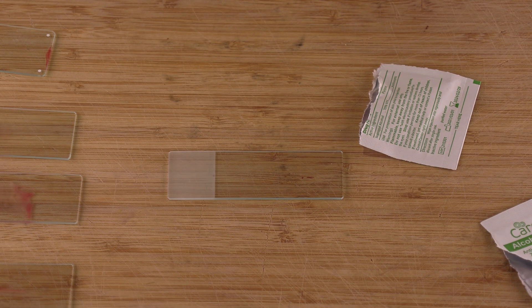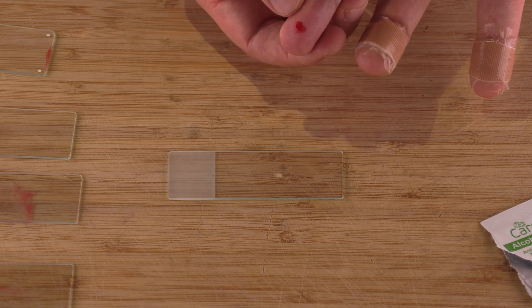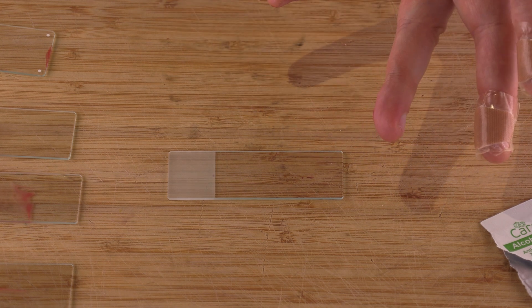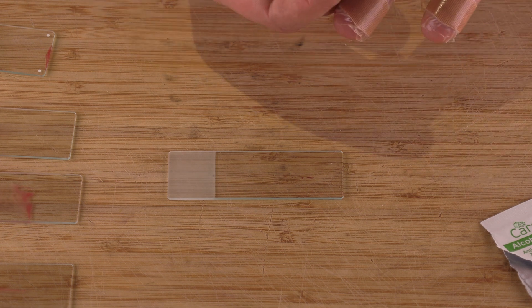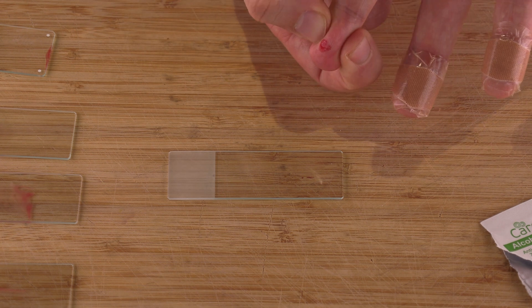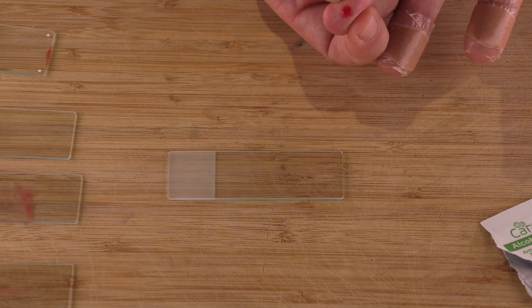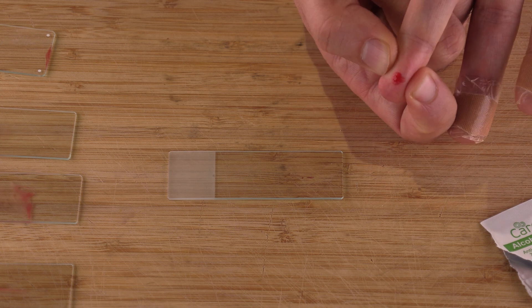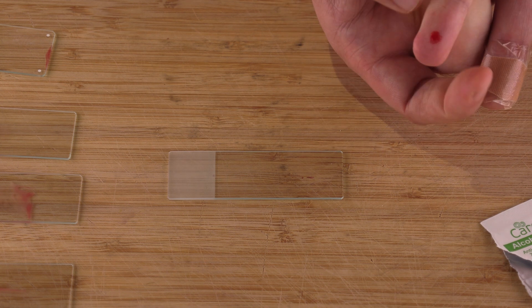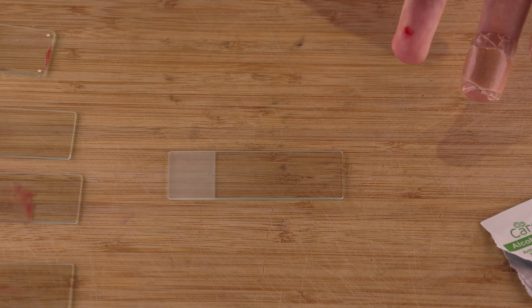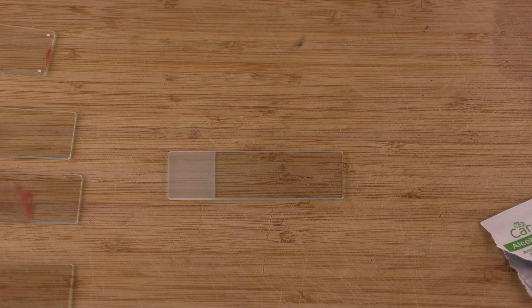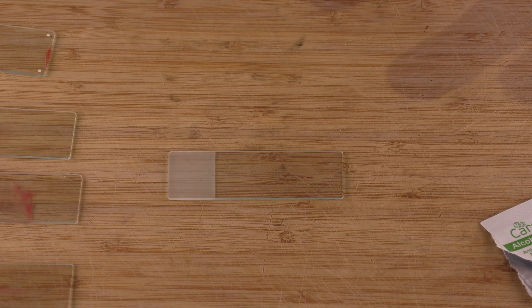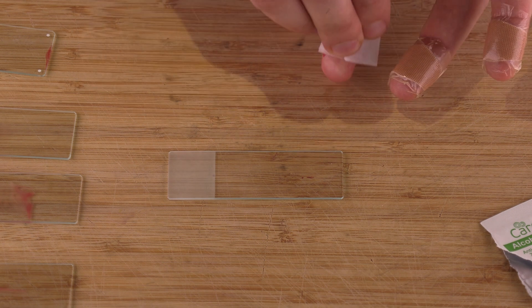Now I'm going to show you my next attempt at making another slide and so I've already applied the purple single prick one and I'm trying to get some blood but you can see here it's kind of flat. I'm not getting that bubble kind of drop that's held up by surface tension so it's not quite what I'm looking for yet and I'm not really happy with it. So you're going to see me wipe this off in a sec here because I'm just not getting enough blood out. I guess the wound kind of closed or I'm starting to coagulate or some combination thereof so I'm just going to wipe it off with an alcohol wipe and kind of start over. Yeah so there I am wiping it off.